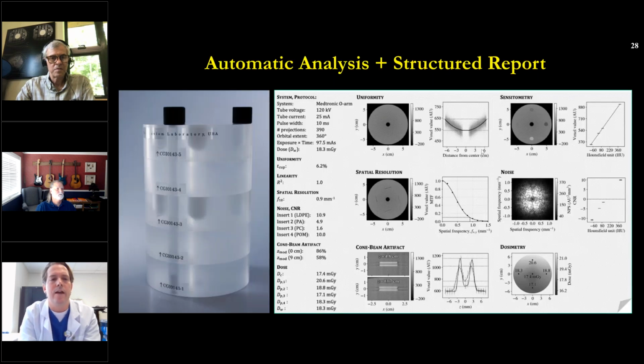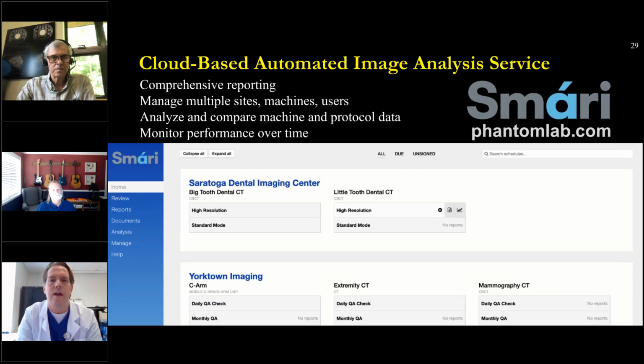All right. So I mentioned that the way of analyzing all the things I showed there is actually automated, and here's that structured report again, which fetched DICOM data if it's available out of the scan. And all of these measures are extracted from a single scan of the phantom. And with that, I actually want to ask Josh Levy to describe how that automated image analysis is being implemented at the Phantom Lab, including a cloud-based service.